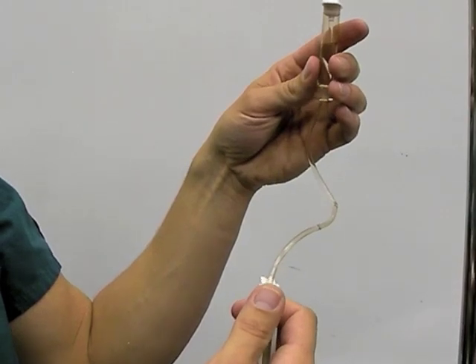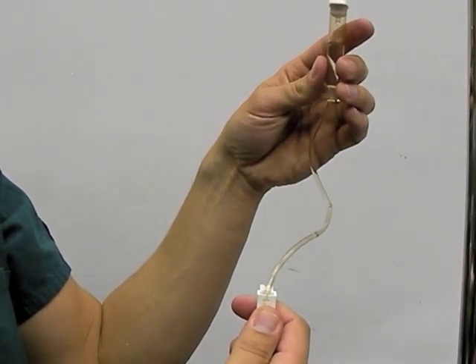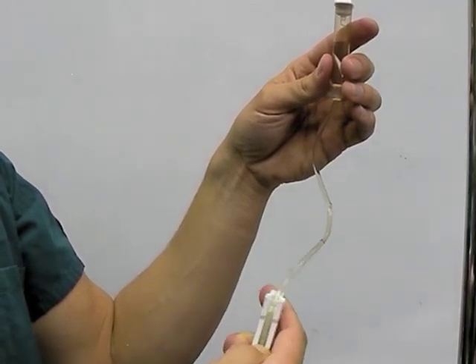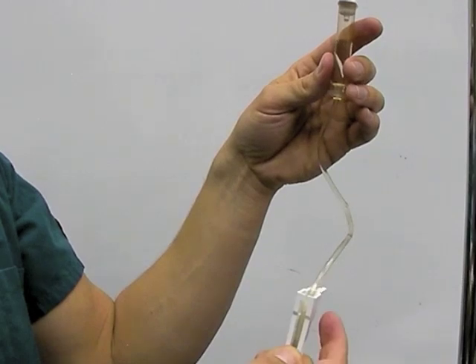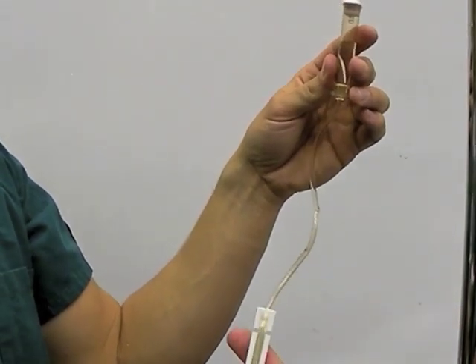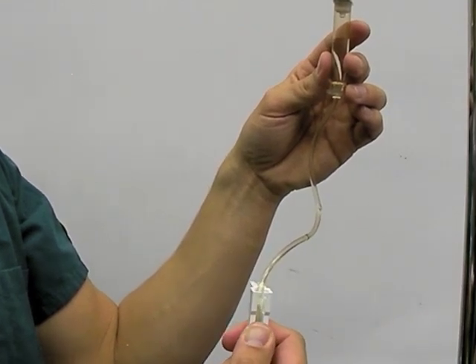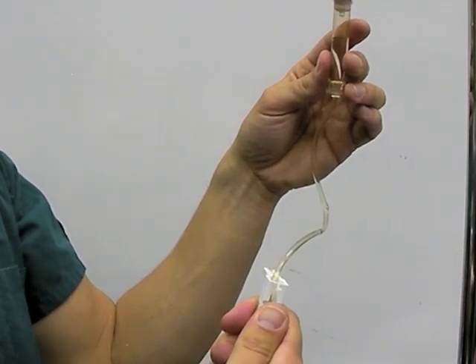If you look, you will see the IV fluid rapidly draining into the drip chamber, and as the wheel is rolled down, the rate of infusion decreases. If the wheel is completely down, the line will be completely occluded. You may then roll the wheel back up from the locked position until the desired drip rate is reached.